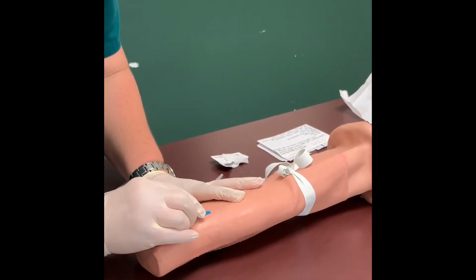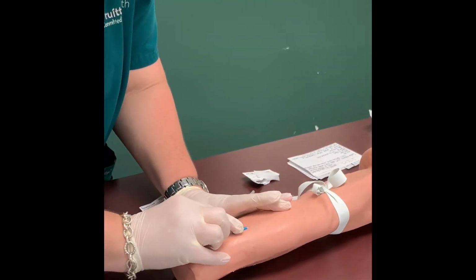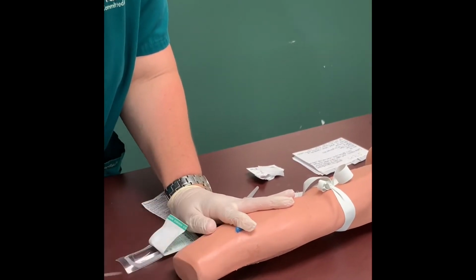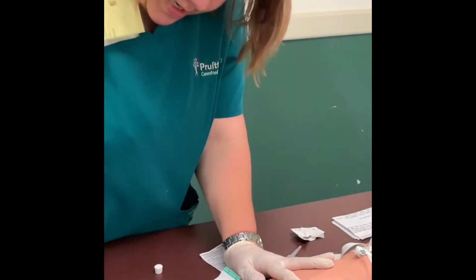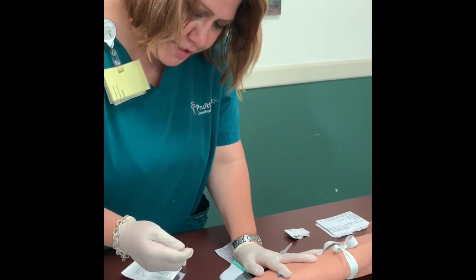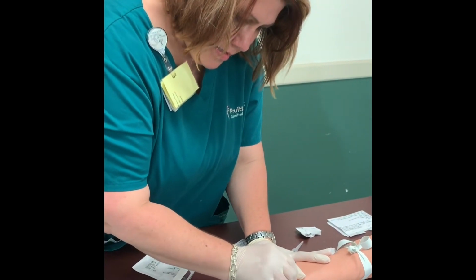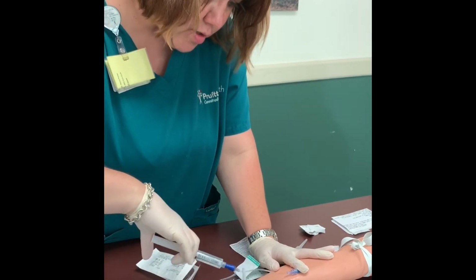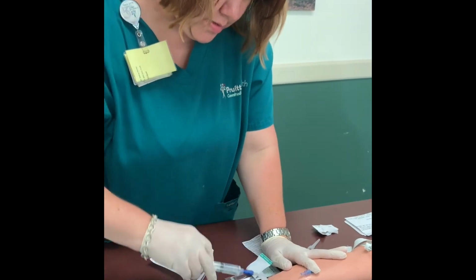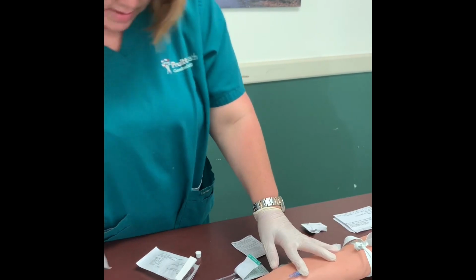And once you get in, you want to advance your catheter, not your needle, because that's how you can cause some of those problems. And you want to hold that in place there. Discard that. Hook your extension tubing up to it. And then you want to make sure that it flushes fine. Make sure all the juice goes in. Once it flushes okay, then you can anchor it down.